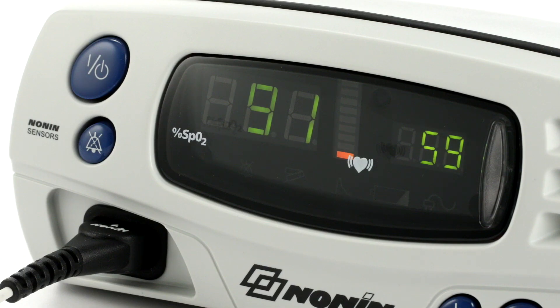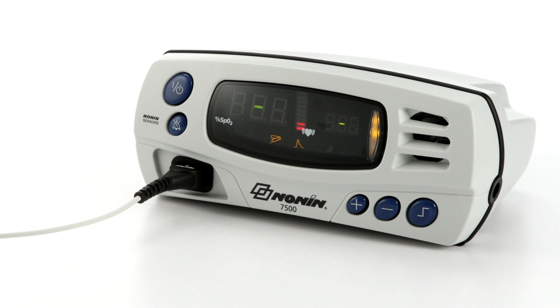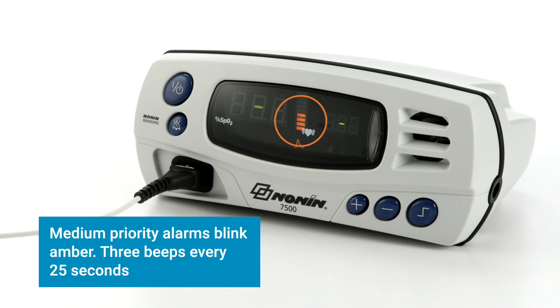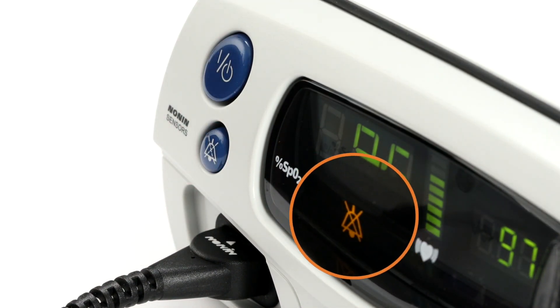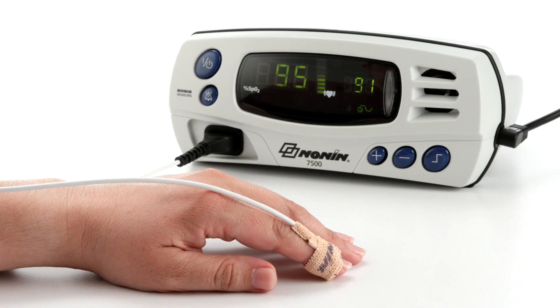For high priority alarms, the alarm LED will blink quickly red and a three-beep audible signal will repeat every 10 seconds. For medium priority alarms, more often generated by an oximeter or sensor signal condition, the LED will blink amber and three beeps will repeat every 25 seconds. You can silence the audible alarm for two minutes by momentarily pressing the alarm silence button, and return the audible alarm by pressing the alarm silence button again. When oxygen level or pulse rate return to the preset range, the alarm will stop and return to normal monitoring function.